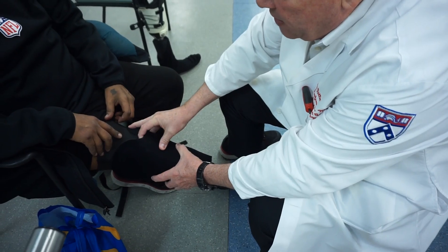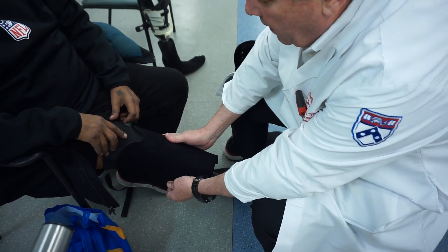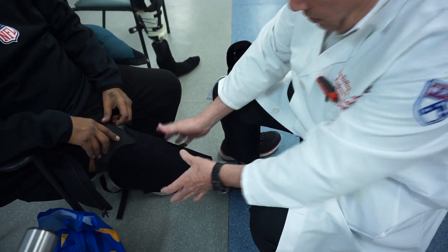You can feel his patella — it's a little high on his patella, but that's okay. Here's the fibular head.